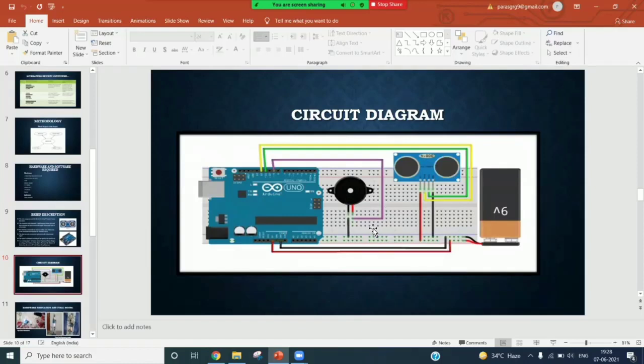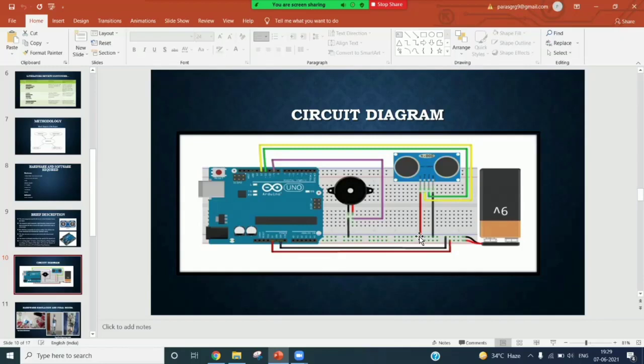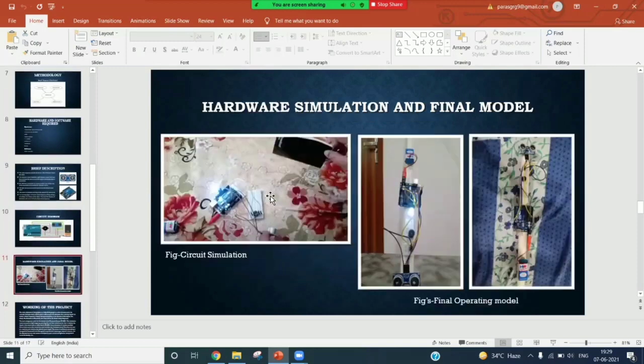The positive terminal of this 9 volt battery is connected to Vin pin of Arduino through a DPDT switch, and the negative terminal is connected to ground pin of Arduino. A buzzer is connected between D9 pin of Arduino and ground pin. This is the hardware simulation we have done.